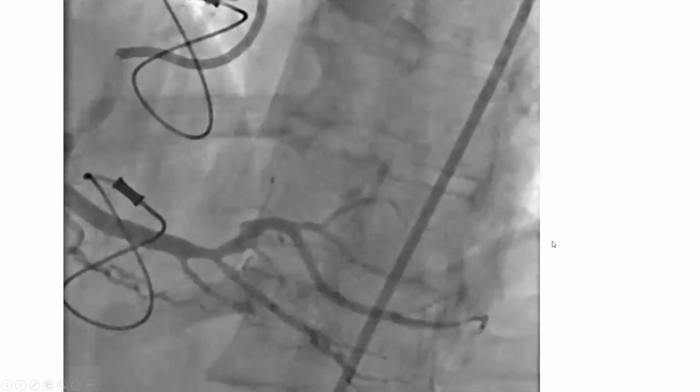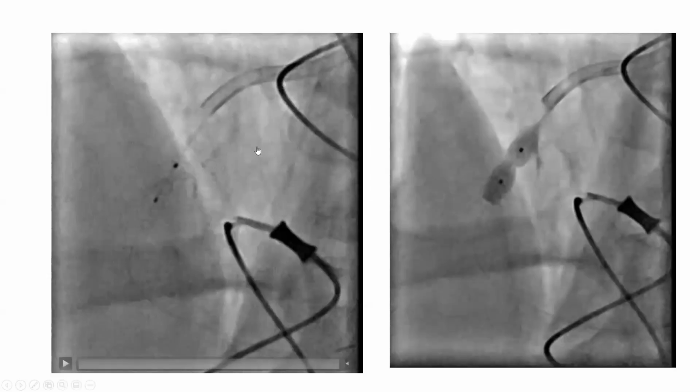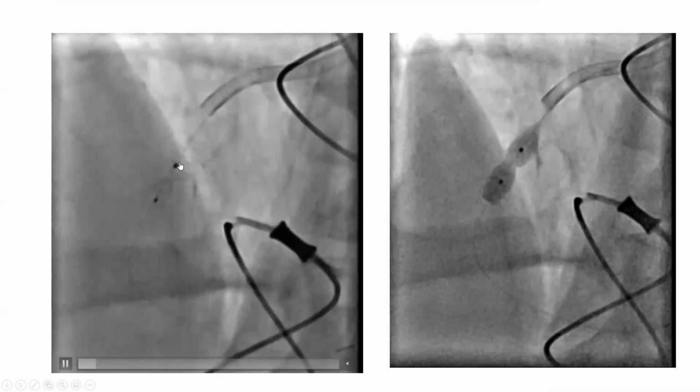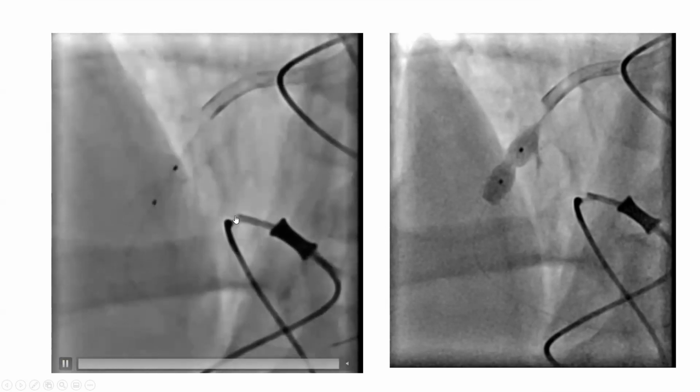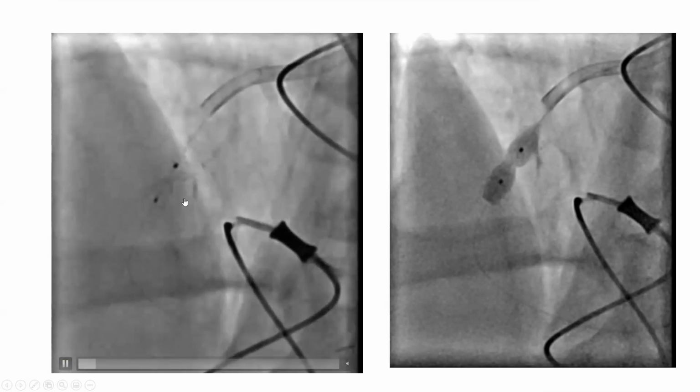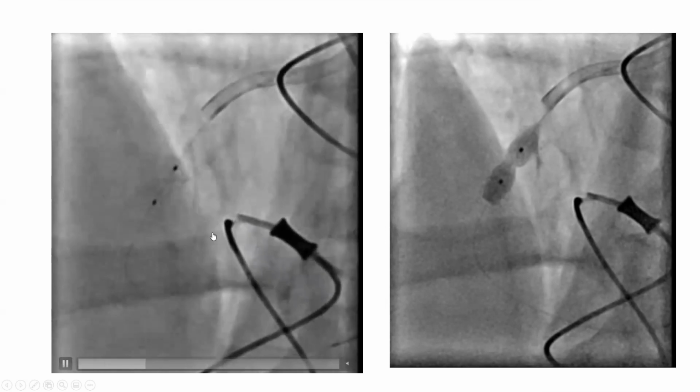So here the operator dilated and placed a stent. Unfortunately, the lesion wasn't well prepped and the stent didn't expand well. That should not happen typically. You try to never stent if your balloon does not fully yield. You want to make sure your lesion yields before you put a stent. Anyway, here a stent was placed and it was significantly underexpanded, as you can see on cine image.